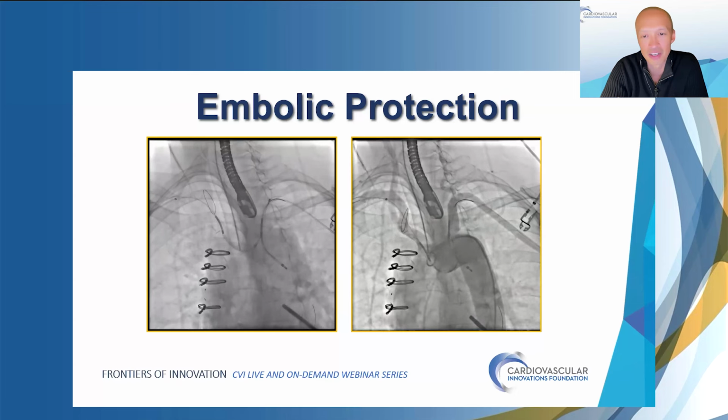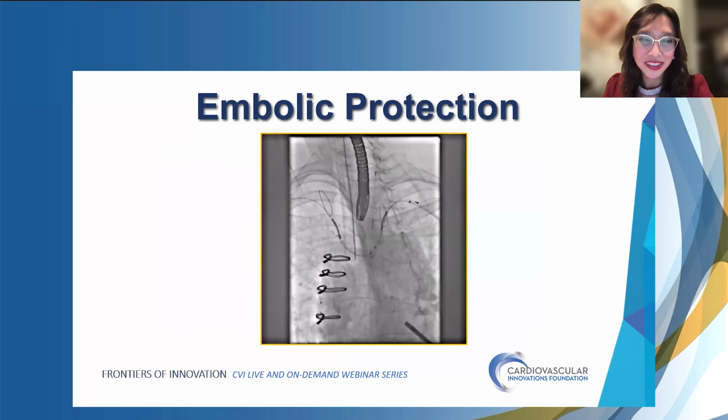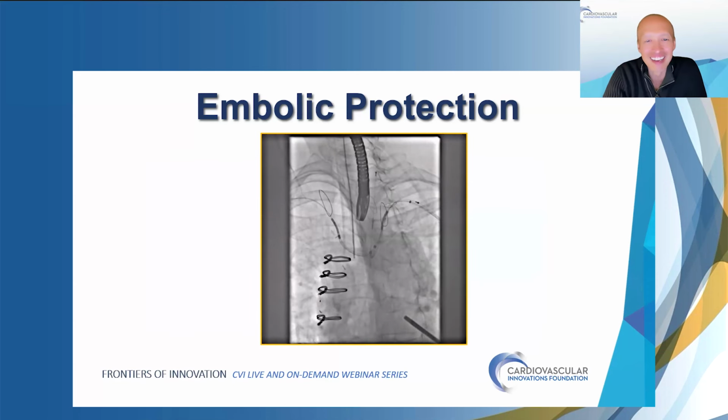It took a little bit of finessing, but we got them both in. I hope you show a slide with them both in. Yes, the next slide, there it is. And actually, what I did is, one device is going to the opposite side, and the other device is coming across, and it worked out well.